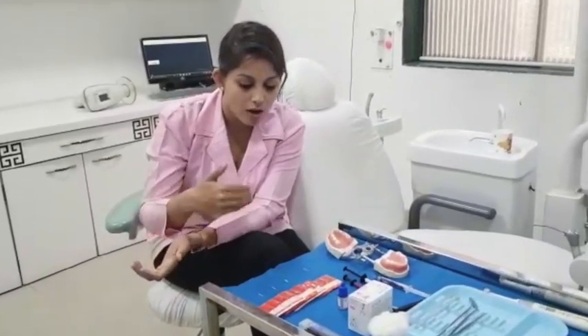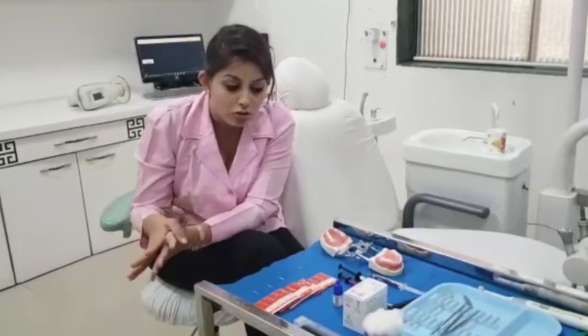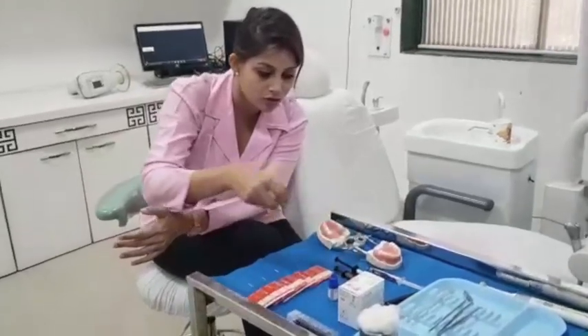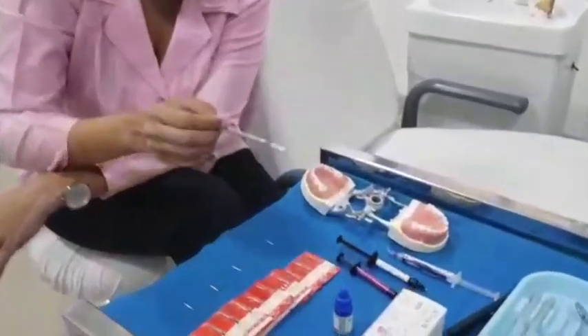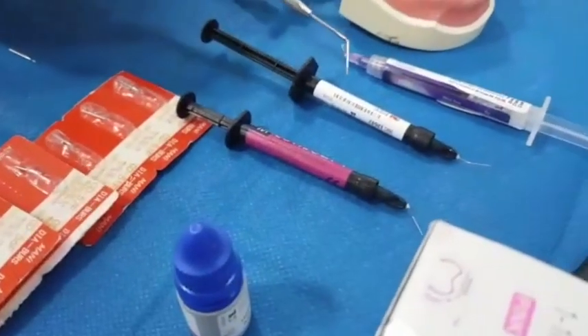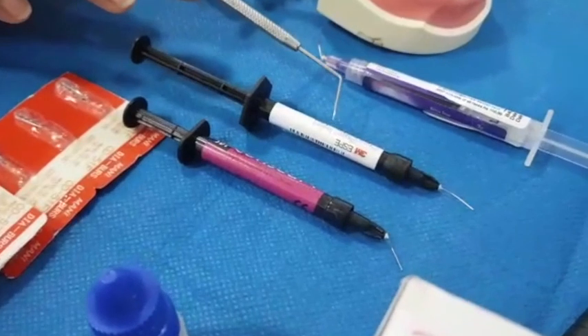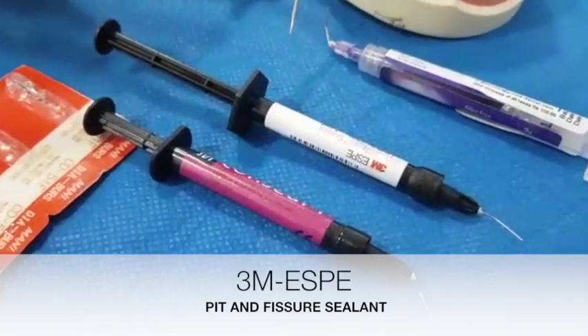Once we move past the fissurotomy procedure, I would like to show you the different sealants we usually use. I have three sealants here. One is the 3M ClinPro — it is also titled as ClinPro Sealant. This is a pink-colored sealant that on curing turns white. Another is from the company SDI — it is Conceal F by SDI.